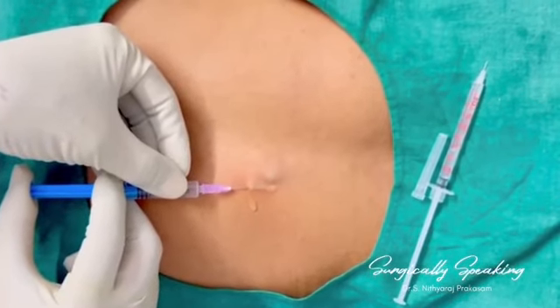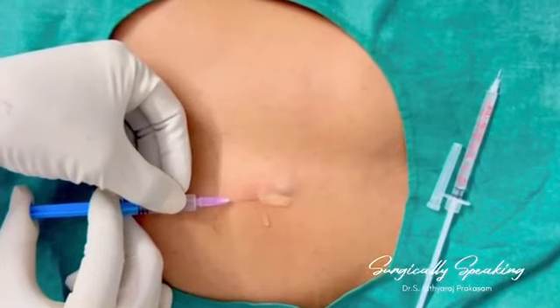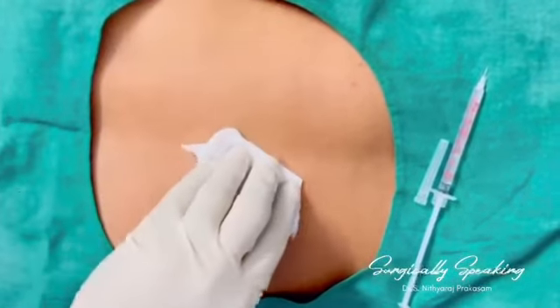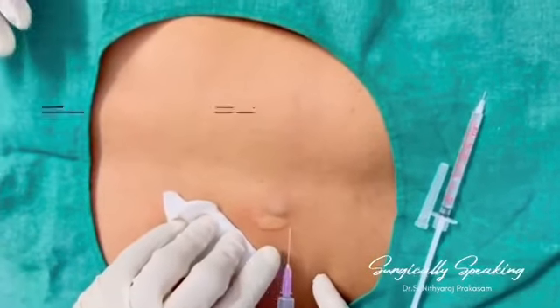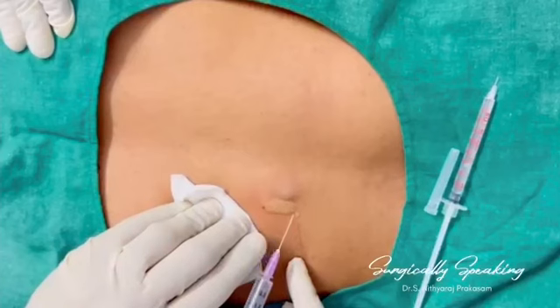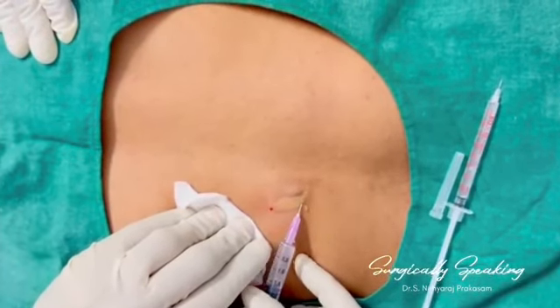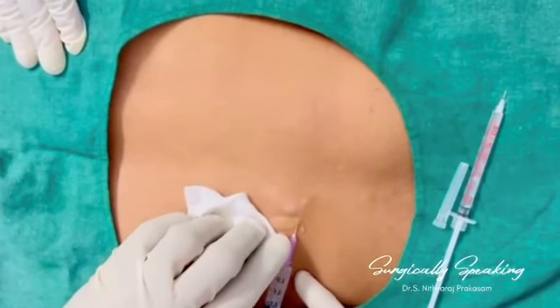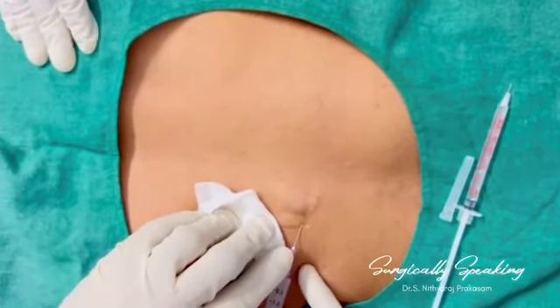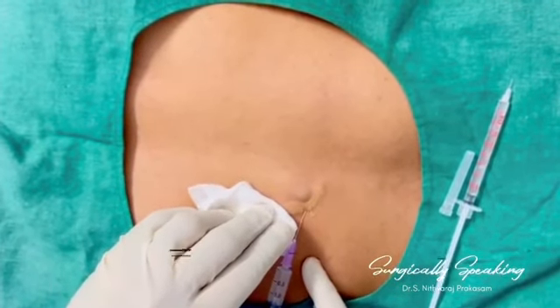You can see the wheal being raised all around. So I'm infiltrating the anesthetic all around in all the 4 directions. I preferably go from the anesthetized side so that the patient feels comfortable during the injection. Before injecting, always aspirate to ensure that we are not inside a vessel.